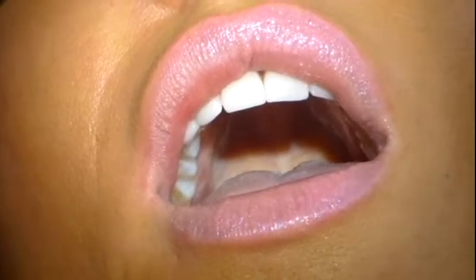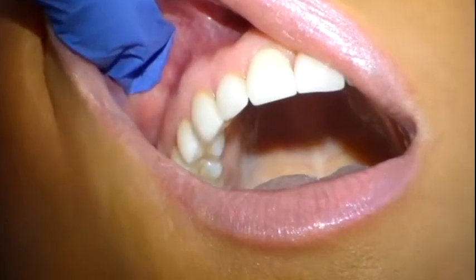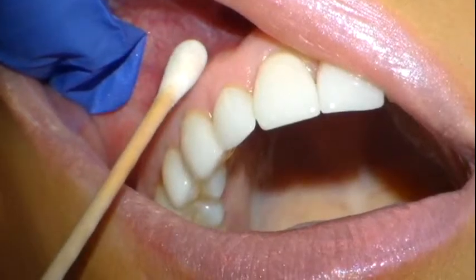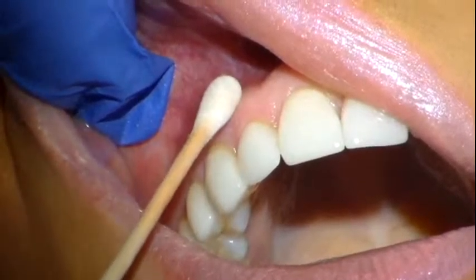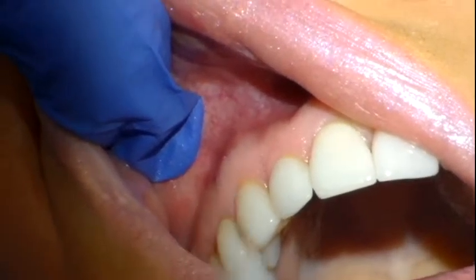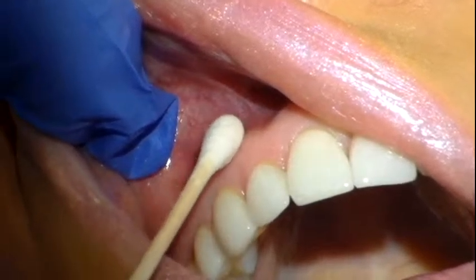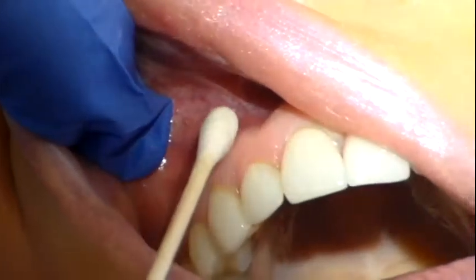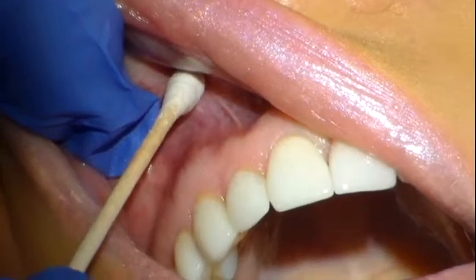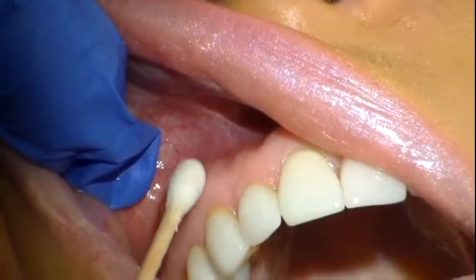Before I do that, I'm going to run through the landmarks. The landmarks for the ASA injection are the canine eminence, and right next door is the canine fossa, and then the height of the mucobuccal fold. And the penetration site is going to be at the height of the mucobuccal fold, just mesial to the canine fossa. So essentially you're directly above the canine fossa here. Okay, and you're about 3 to 4 millimeters mesial to that canine eminence.